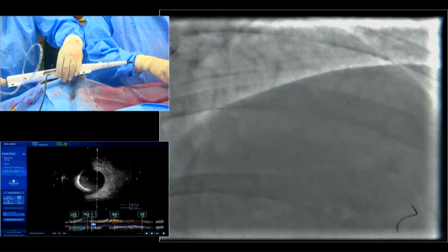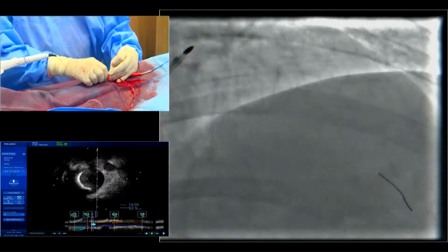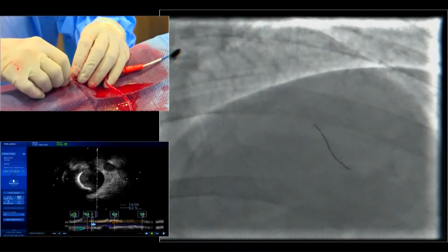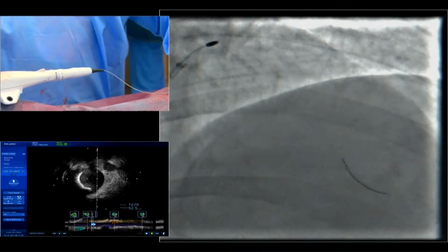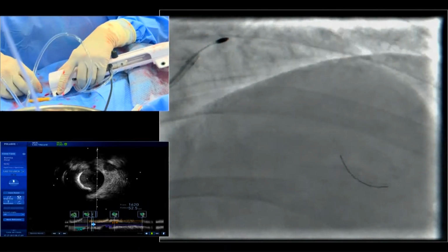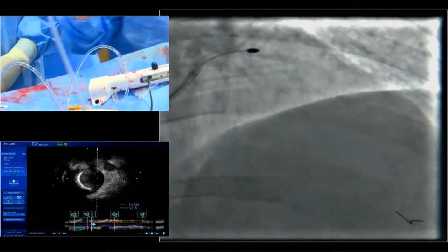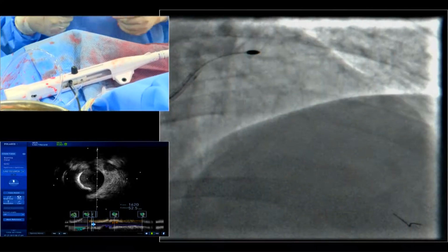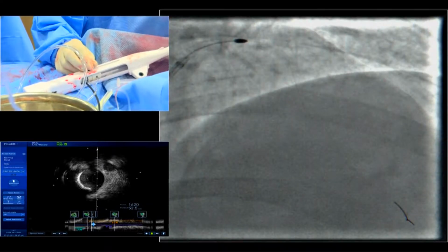Wait, sir. Turn out to push. Your wire is coming back. That's it. Wait, correct. Yeah, no problem. Put the Dynaglide on. Dynaglide on. Press Rota. Press Rota. Okay, that's it. Come on. Very good. Of course, wire clip off. Dynaglide. Okay, Saurav. Okay. Ready.